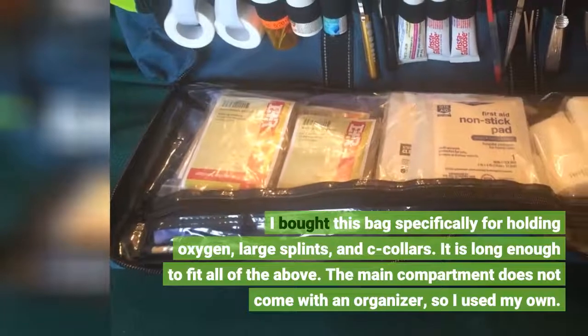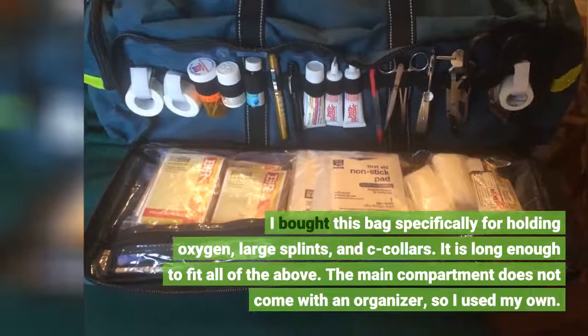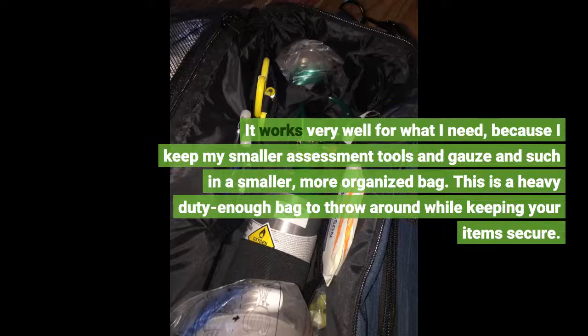I bought this bag specifically for holding oxygen, large splints, and cervical collars. It is long enough to fit all of the above. The main compartment does not come with an organizer, so I used my own. It works very well for what I need, because I keep my smaller assessment tools and gauze and such in a smaller, more organized bag.